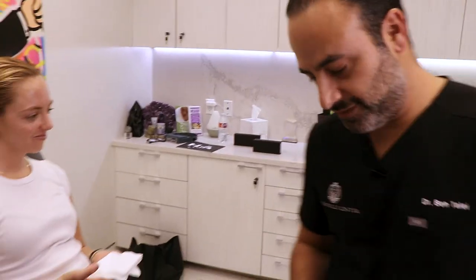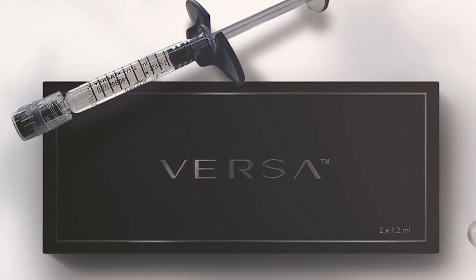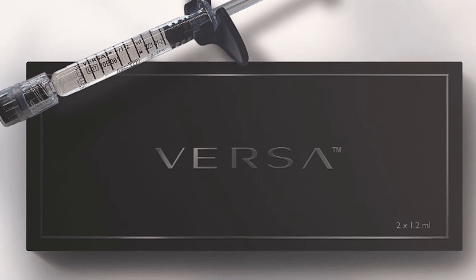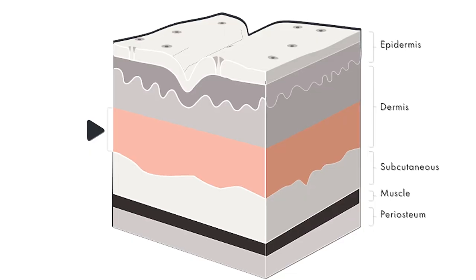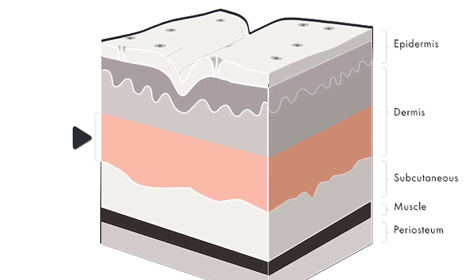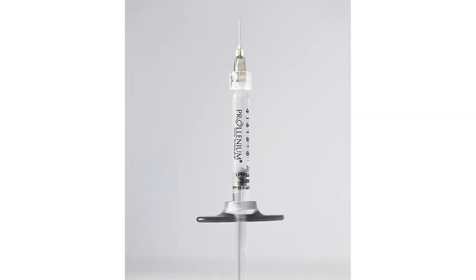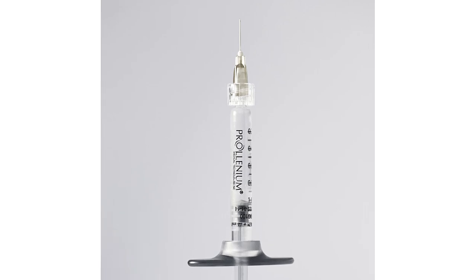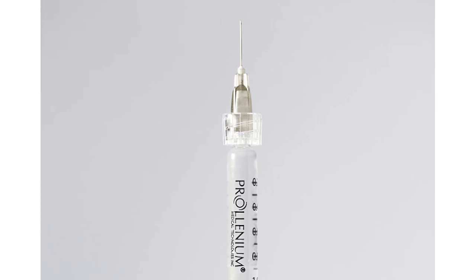Let's play first with the chin and the jawline. For this we're going to use Reveness Versa — this is their classic filler, which is fantastic. It is one of the newer types of cross-linking, which is a little bit more linear in how it injects. It's very smooth and can be used in soft tissue under the dermis, or going up onto the bone as well. Very easy to inject. It comes with a 27-gauge needle, which is kind of on the big side, but that's fine for a smooth filler placed on the jawline.